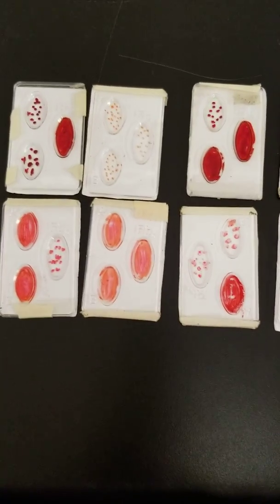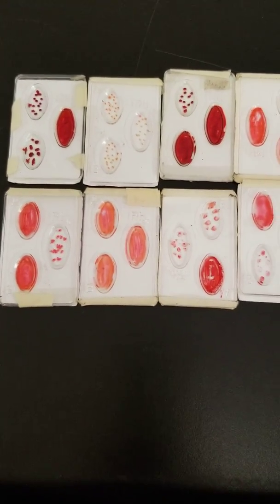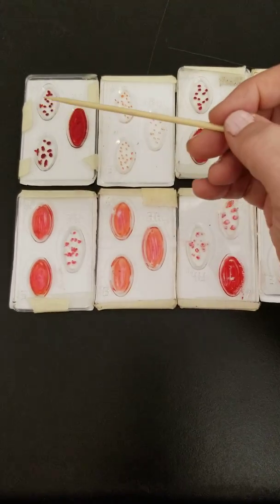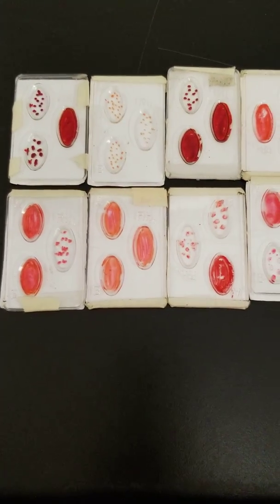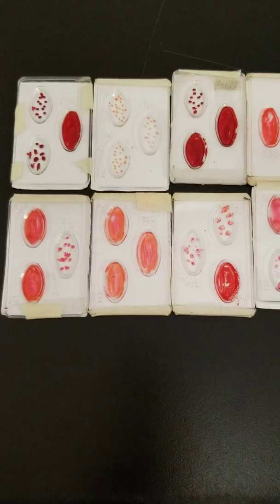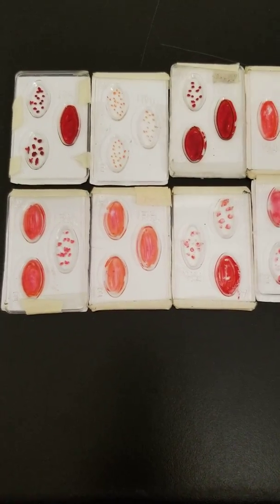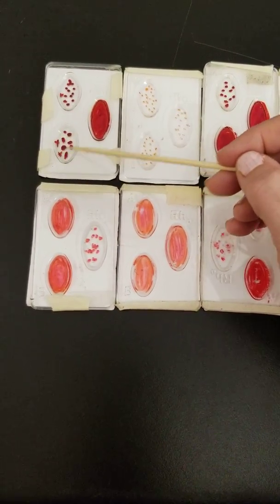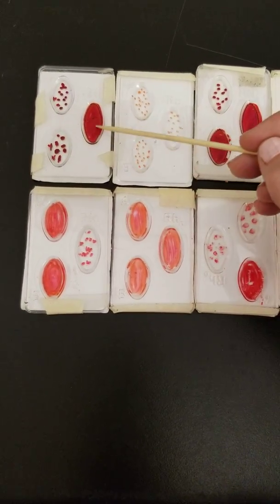The other part of this is blood typing. When you're looking at these little cards, the thing to remember is you're looking for clumping as a positive indicator. On these little things, A is here, B is here, and RH factor is here. So if you see the dots, that represents clumping or agglutination. That means it is positive for that antigen. For example, this one is clumping in the A and in the B, but not in the RH. So this would be blood type AB negative.